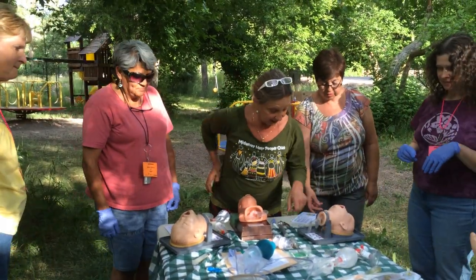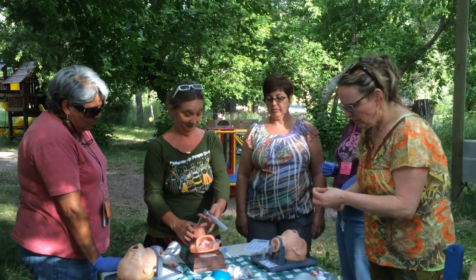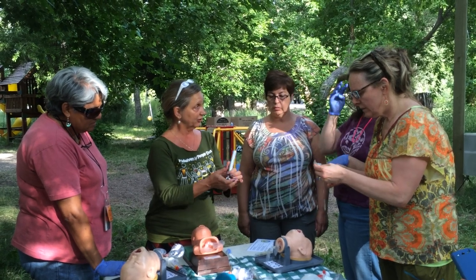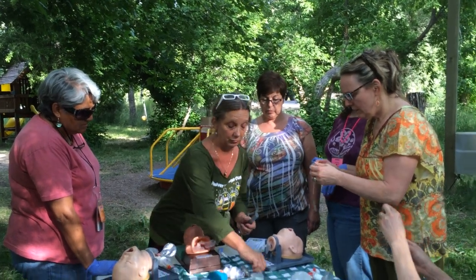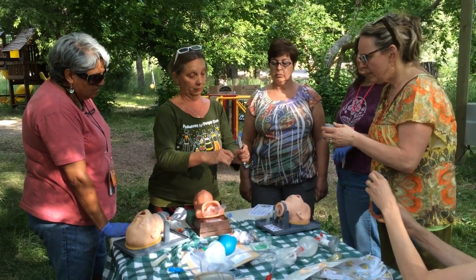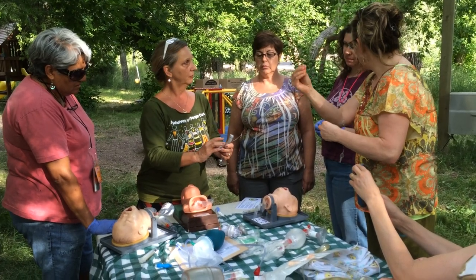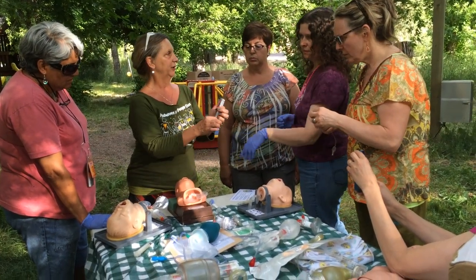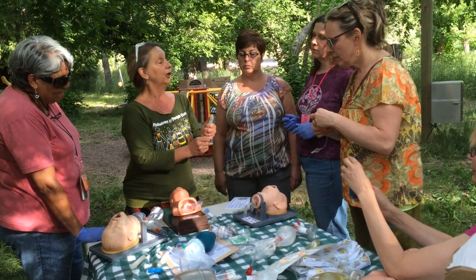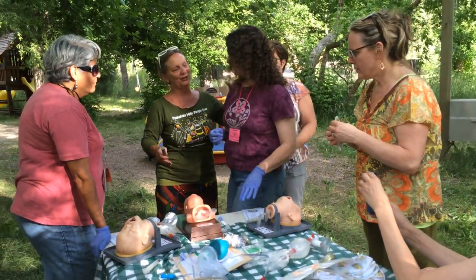Imagine if it had this. That's your other option. So we do this. This is the laryngoscope. This is what you use to insert an ET tube. That could do a lot of damage. You know, it's inside the tube, right? It's a stylet just to give it stability. What does the damage is this. And the fact that you don't know what you're doing. So you can tear the vocal cords. Come on over here. Let you show us how to do it wrong.